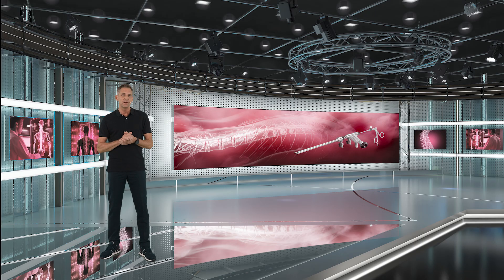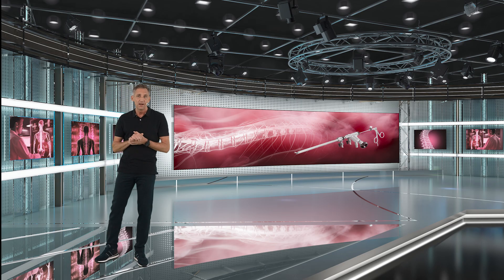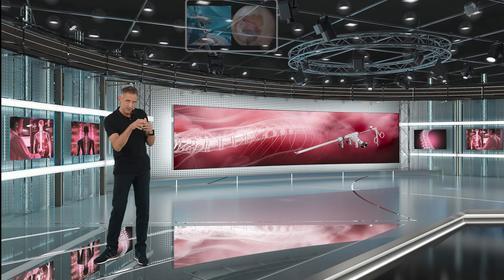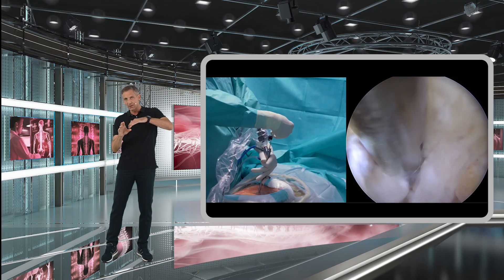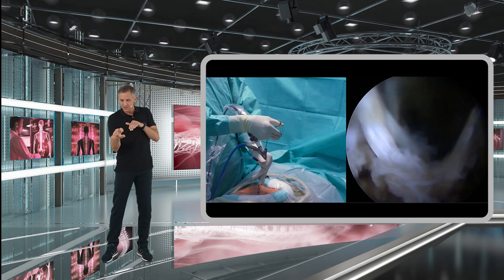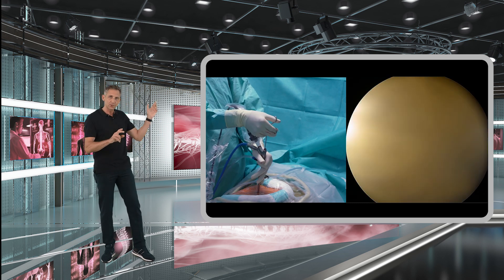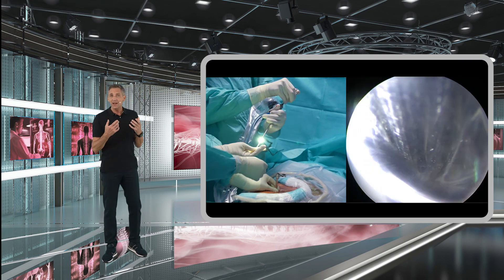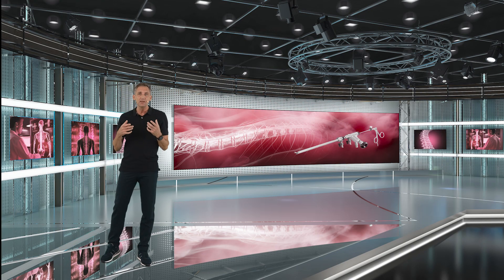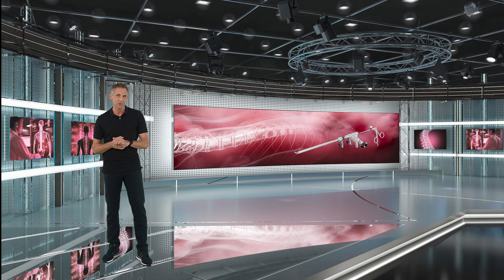Please remember that the working channel is located eccentrically. If you can't seem to get underneath the nerve root, simply rotate the endoscope, advance your forceps, and then rotate the endoscope back — as you can also see in this video. This is an extremely useful tool that you can use in many of your surgeries.